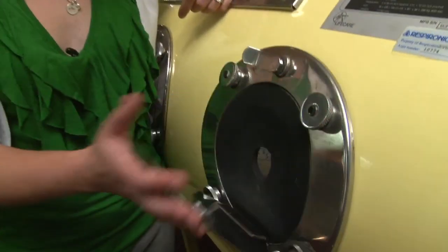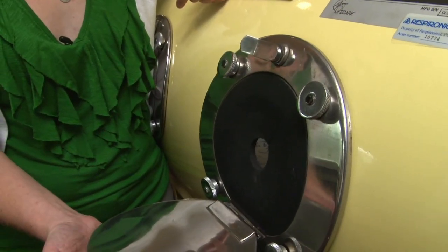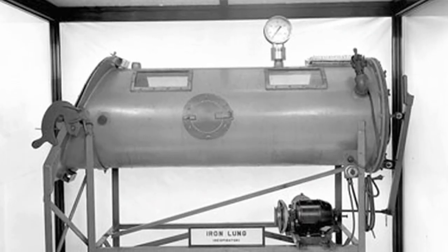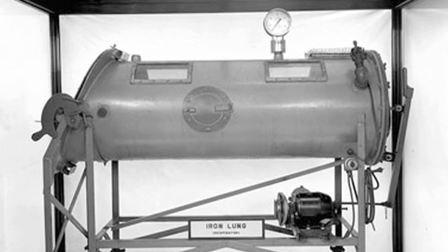John Emerson, who ran a medical machine shop nearby, also saw their model. He made some improvements, including ports on the side where nurses could access the patient for care, and a bed that slid in and out. His first machine is now part of the Smithsonian Institution at the National Museum of American History.